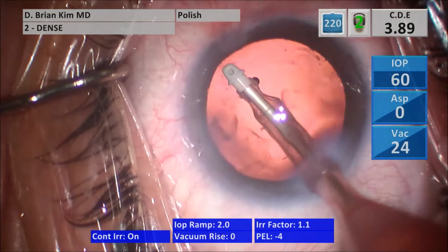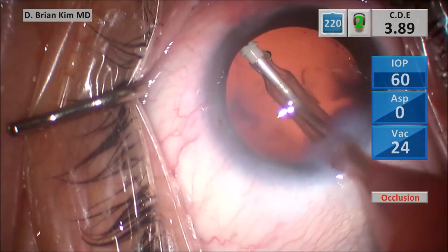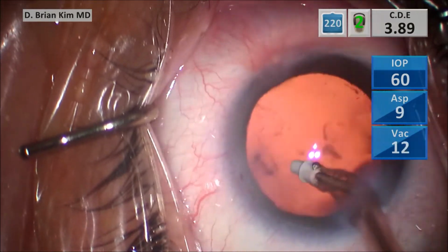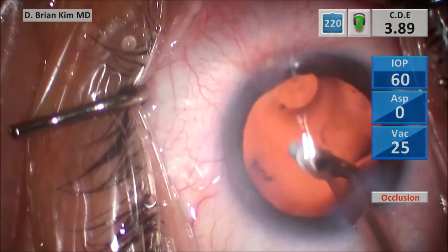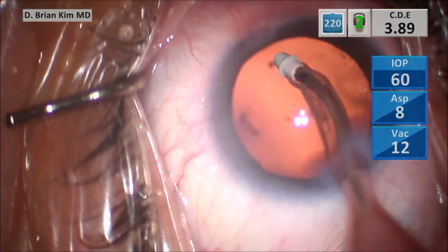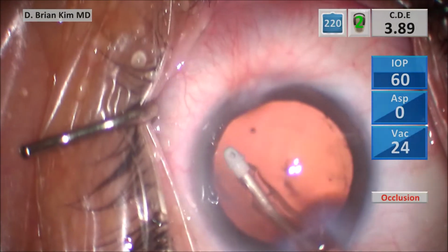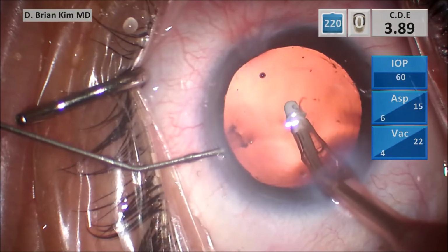You're able to grab it and then switch to cortex mode and then back to polish mode as needed. By doing it this way, I'm able to be more confident when I remove the cortical material. Again, with polish mode, you can be very confident. You can place that tip deep into the capsular fornix. You're not going to grab the zonules. You're not going to grab the bag. You're not going to cause any major complications. The chances of PC rupture are extremely low with this polymer tip with the low flow setting.